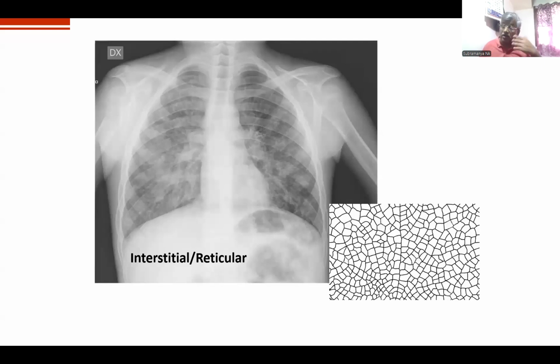Now, in the same way in interstitial diseases, replace the colon with the bronchi. If I push more air in the airways, you can see the interstitium better. They are like colonic mucosa. I'm just giving you a parallel. I'm sorry, it does not come to my mind how best I can explain this, but don't worry about it too much.